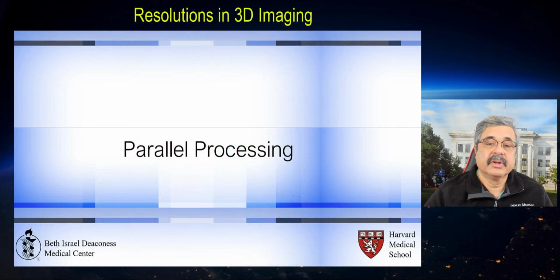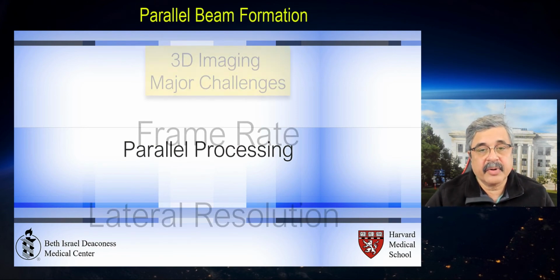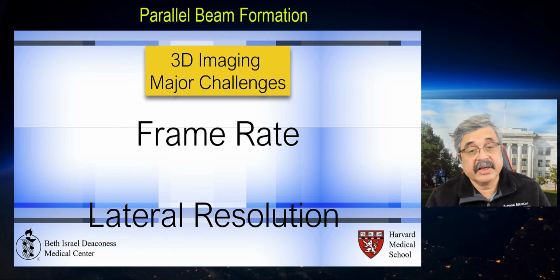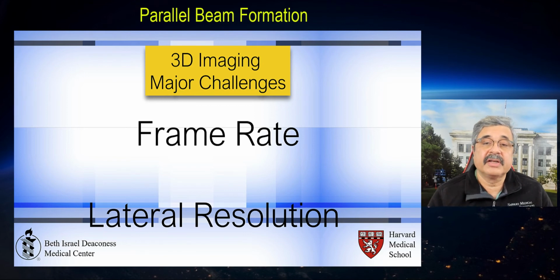Now, to do away with this, what was developed is referred to as parallel processing. In three-dimensional imaging, the major challenge is frame rate, which means your temporal resolution gets hugely compromised once you increase the sector size, not only in the lateral direction, but also in the elevational dimension.